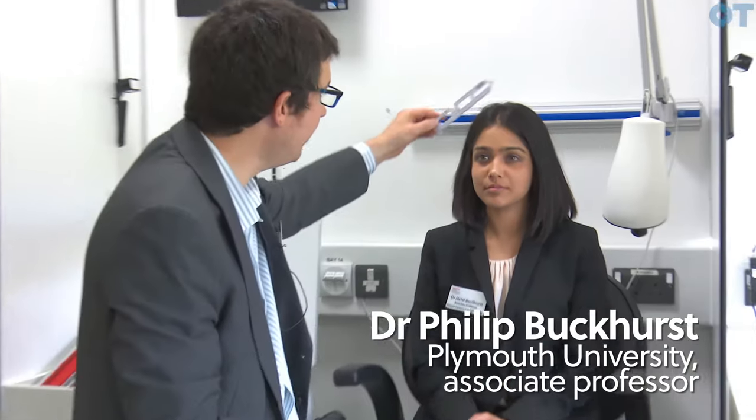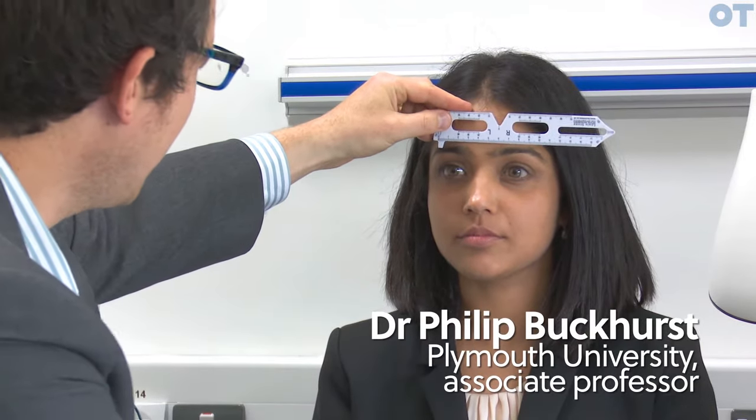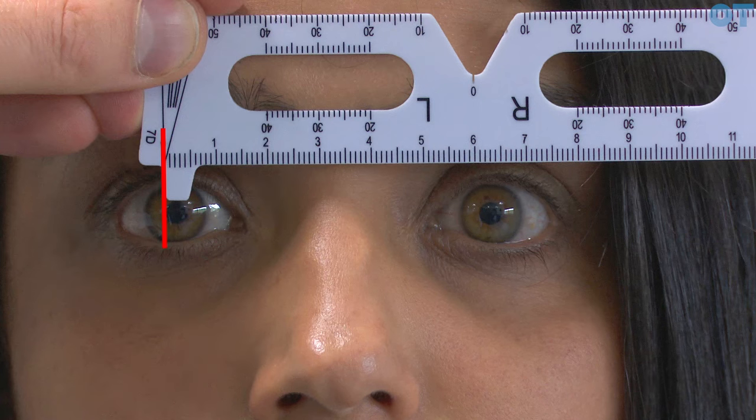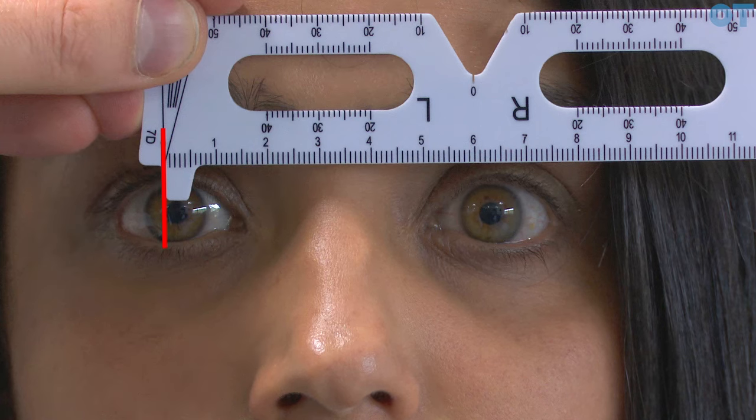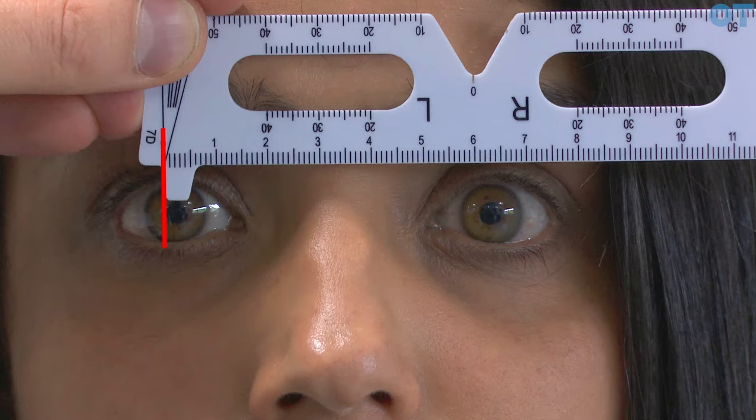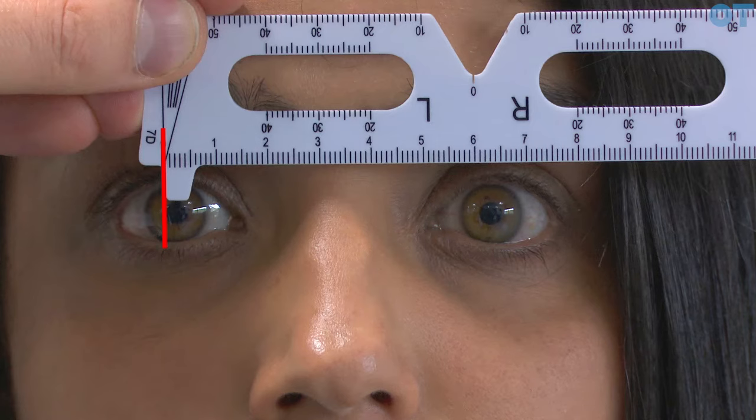We're looking to measure the distance between the patient's pupils. First we close our right eye and get the patient to look directly into our left eye, and we line up the PD rule with the temporal side of the patient's pupil.